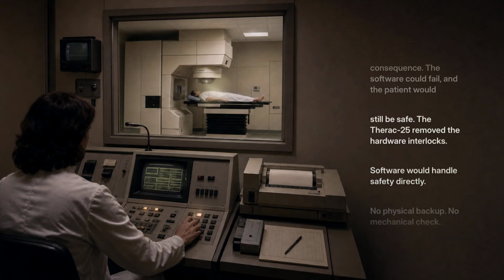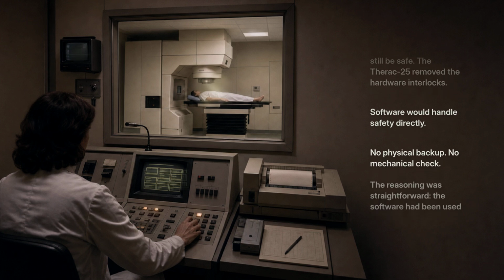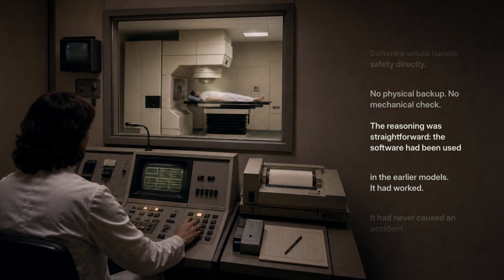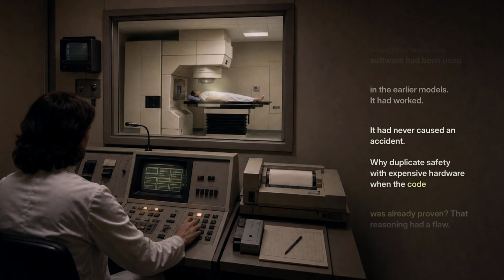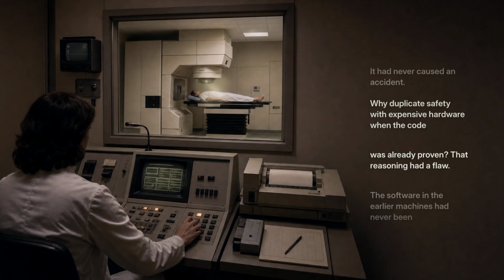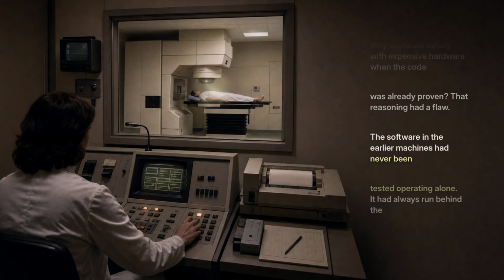The Therac 25 removed the hardware interlocks. Software would handle safety directly. No physical backup. No mechanical check. The reasoning was straightforward. The software had been used in the earlier models. It had worked. It had never caused an accident. Why duplicate safety with expensive hardware when the code was already proven?